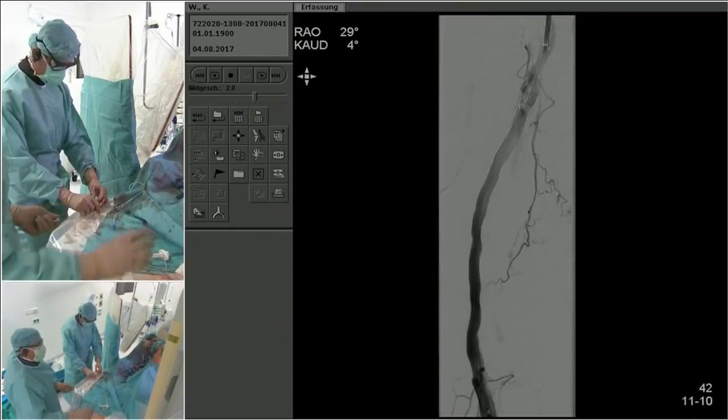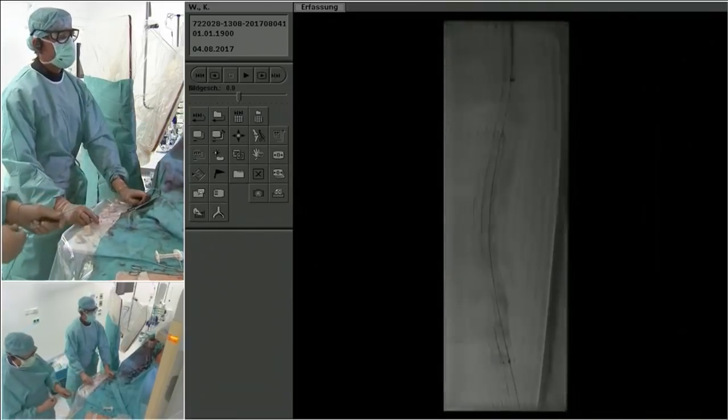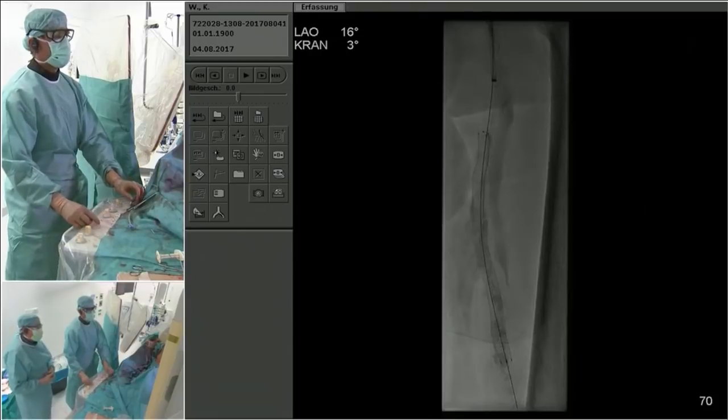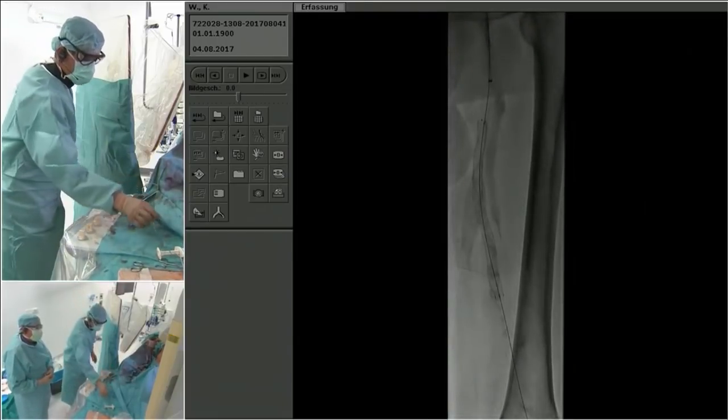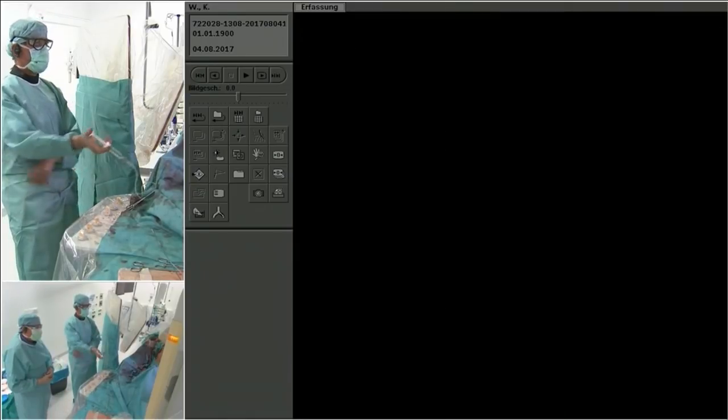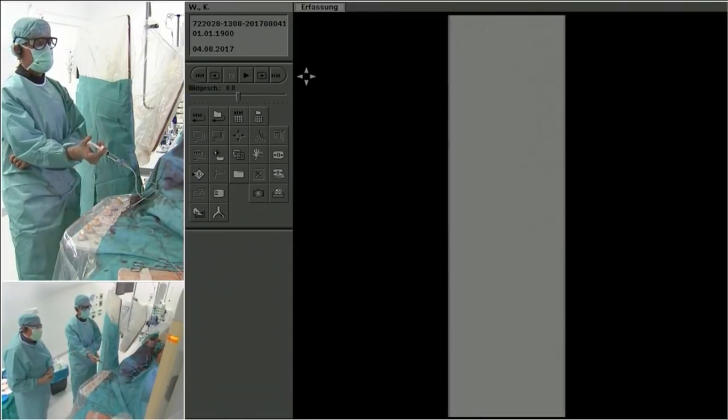Ehrin, you change your mind? Well, I want to look a little closer at the mid segment of that Viabahn. There is some recoil, and if we convince ourselves that that recoil is not significant, either hemodynamically or with other imaging, then I would say we could stop. But I do want to make sure there's not significant recoil in the mid segment of that Viabahn.